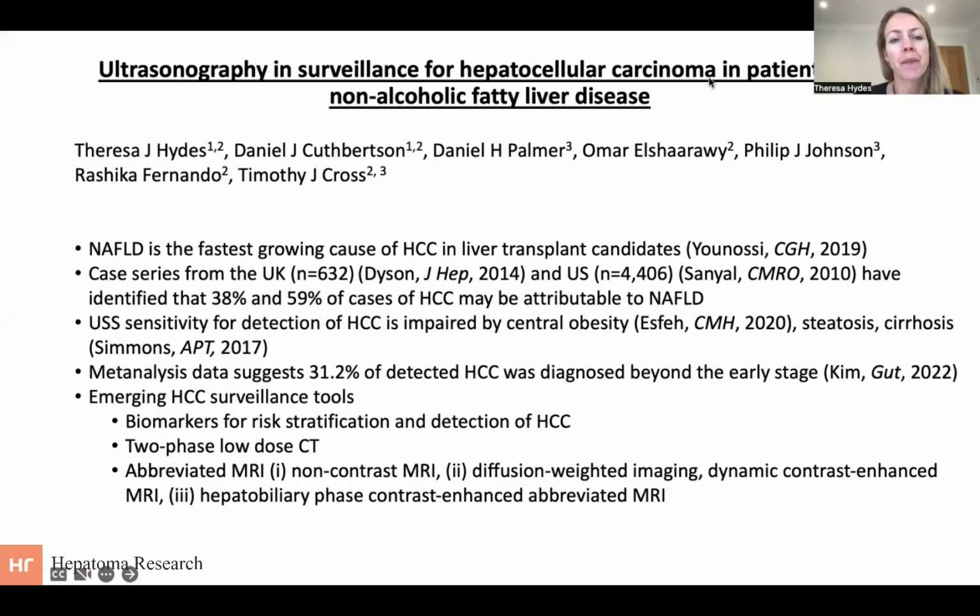Hi there, I'd like to present a short video abstract of our narrative review looking at ultrasonography and surveillance for hepatocellular carcinoma in patients with non-alcoholic fatty liver disease. So NAFLD is the fastest growing cause of HCC in liver transplant candidates, and case series from the UK and the US have identified that between 38 and 59% of cases of HCC may be attributable to NAFLD. But this presents a problem for the use of ultrasound scan surveillance.